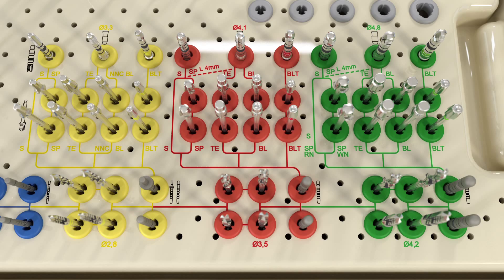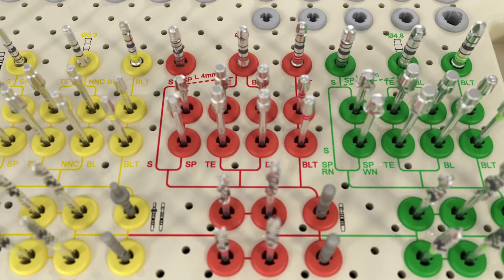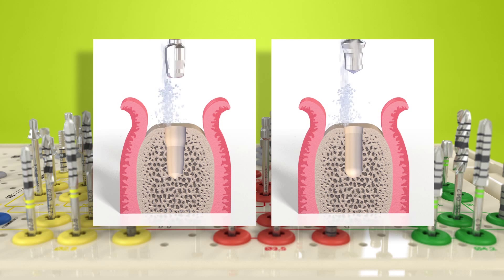After the basic implant bed preparation, the colored workflow lines lead to the profile drills, which are required for fine implant bed preparation. These drills help to prepare the implant bed according to the coronal aspect of the implant design, the implant type, and diameter.